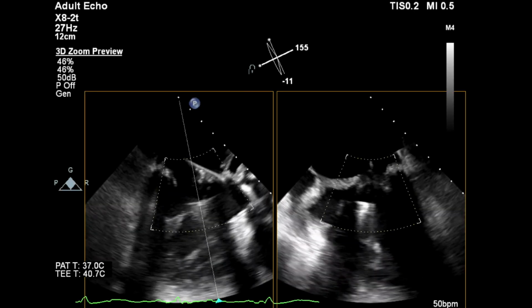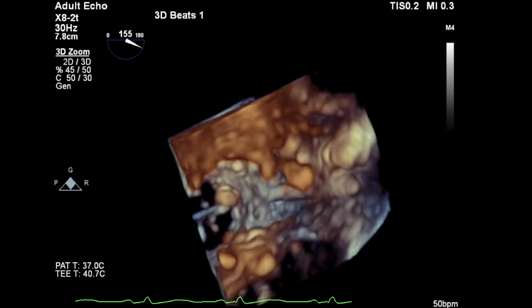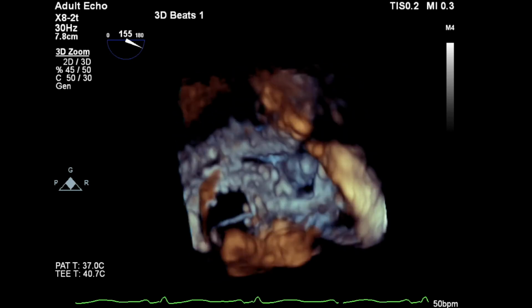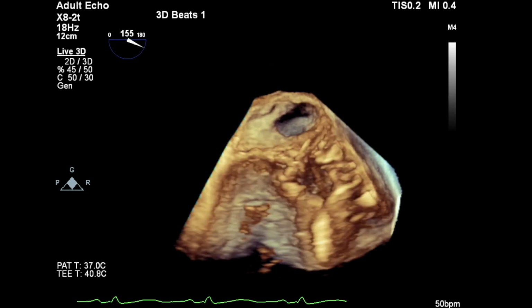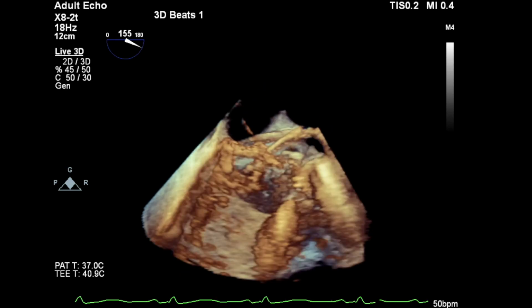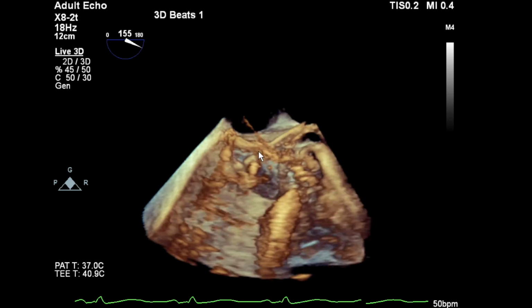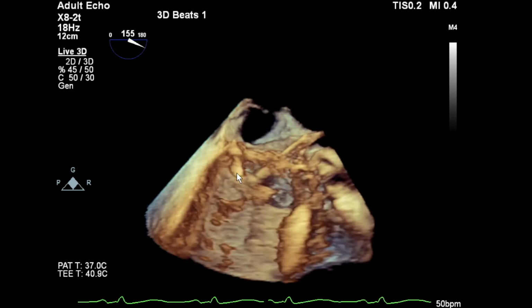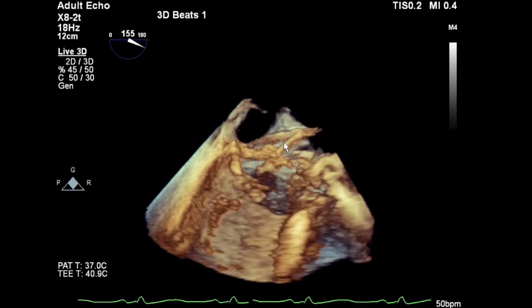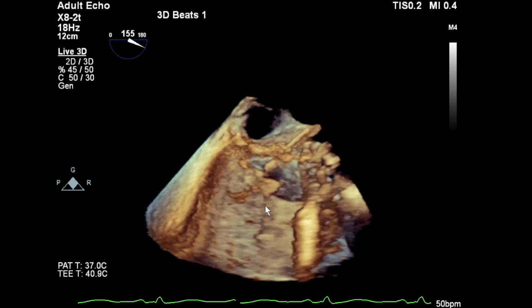If we had the retrograde approach, then seeing one of the discs in the LA, very easy. This is very difficult in the left ventricle. Close enough. There you go. Yeah. Okay, that's it. So that's looking like the long axis. So I want to orientate it along the mitral valve annulus. So that looks as though it will do it. It's lying like this at the moment. And as it gets closer here, the annulus is there, in that direction. So it's 90 degrees to the way you have it currently.